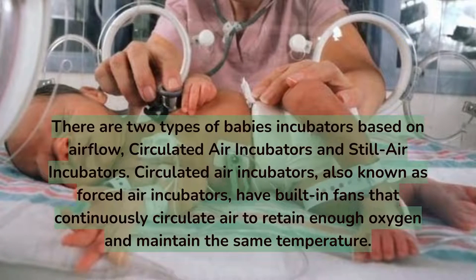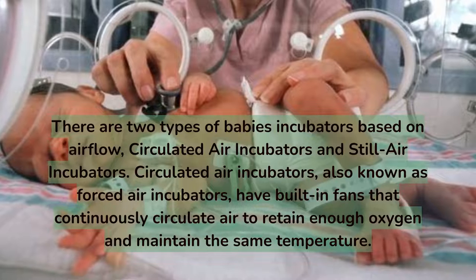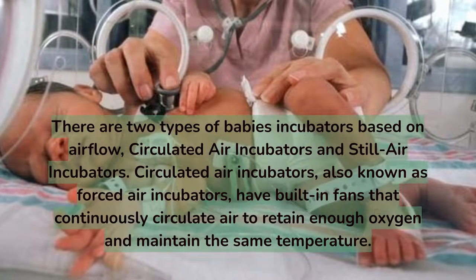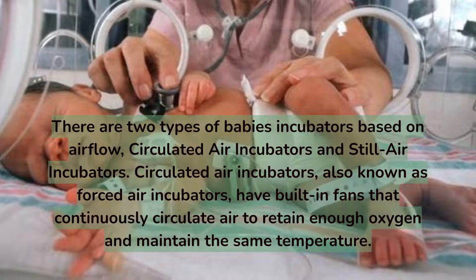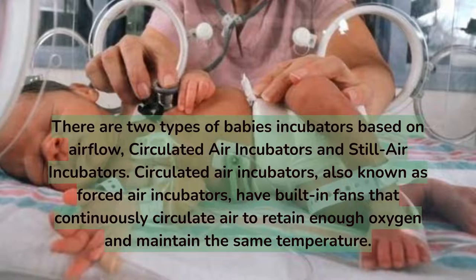There are two types of baby incubators based on airflow: circulated air incubators and still air incubators. Circulated air incubators, also known as forced air incubators, have built-in fans that continuously circulate air to retain enough oxygen and maintain a consistent temperature throughout the cabinet.